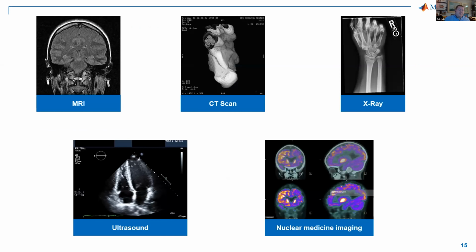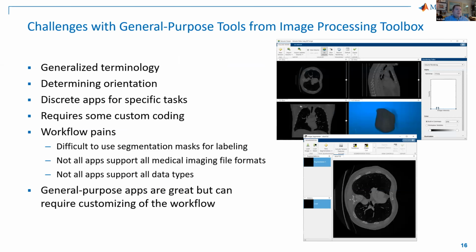And what I can do is talk about a couple of these things. For these new tools, they're meant to support radiological images: MR, CT, X-ray, ultrasound, and nuclear. And what the general changes are for this toolbox is that our new tools are specific for medical imaging workflows.